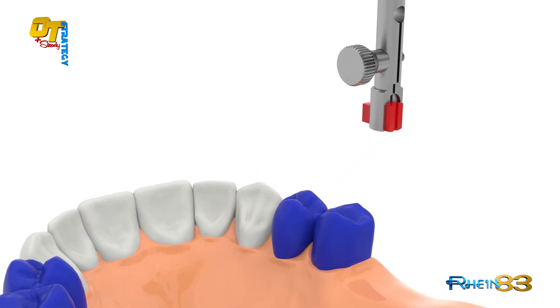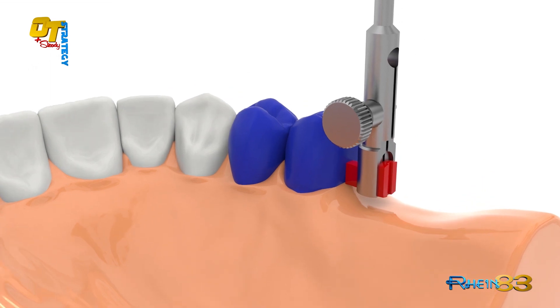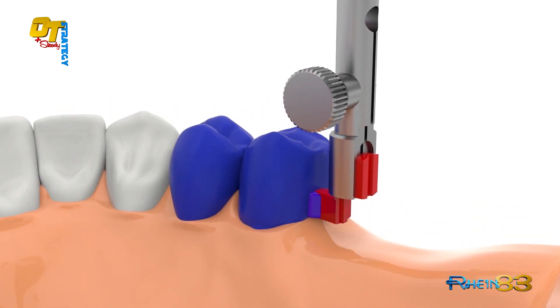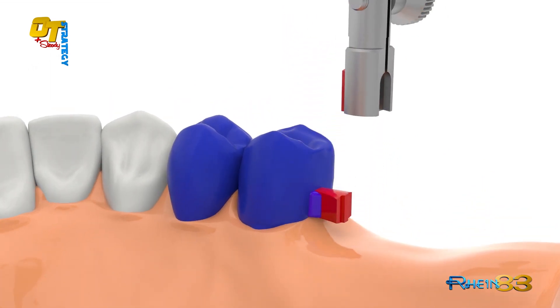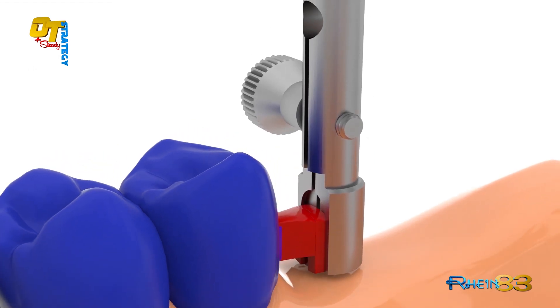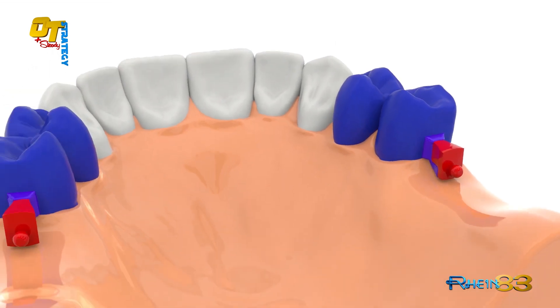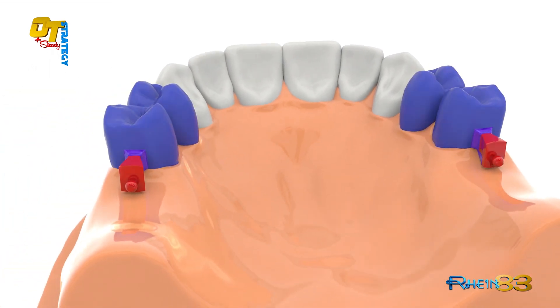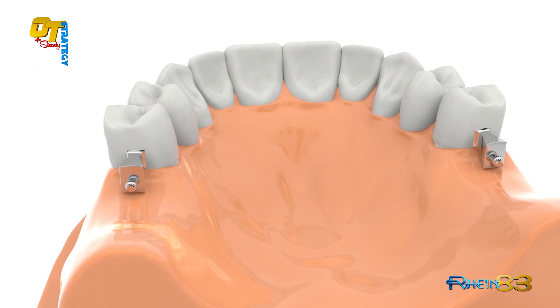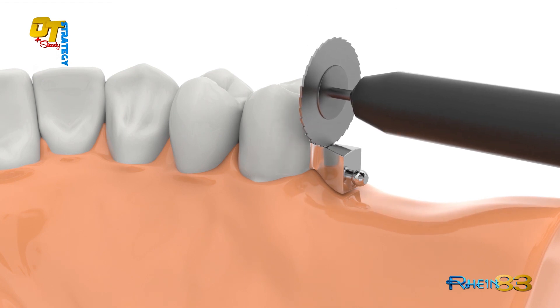Connect to the wax crown, then turn the key and connect the castable OT strategy sphere with the OT steady in the groove provided. Fill the empty spaces with wax, complete the design and cast. For best results, it is recommended the casting alloy is over 240 Vickers hard.